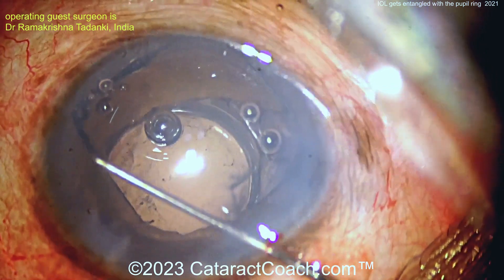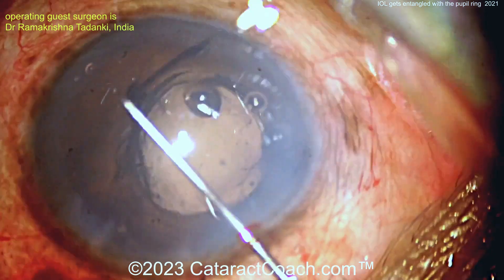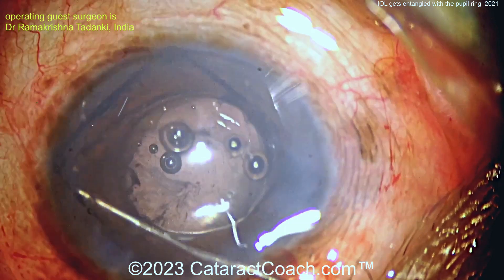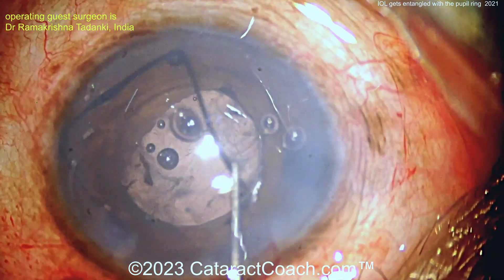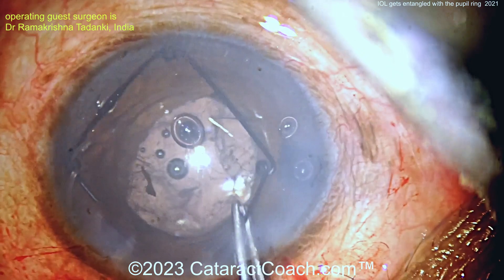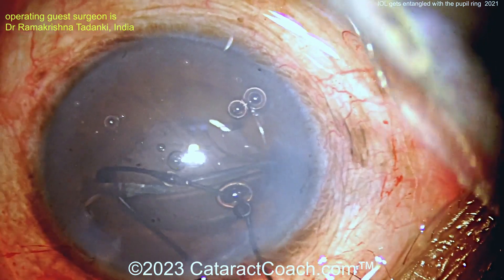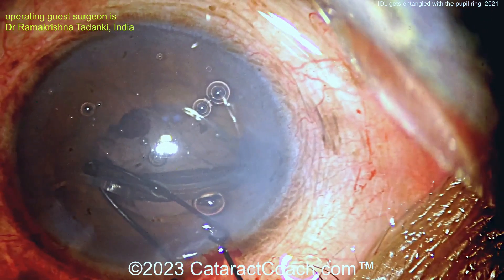Move the ring around — it's still caught. The IOL is like partially above the ring. You've got to get the ring and get that trailing haptic — push it through the ring. The ring is on top now. Because if you try to explant the ring, it's going to catch that haptic. You don't want to damage that lens or scrape the endothelium. Now the lens is going upside down.